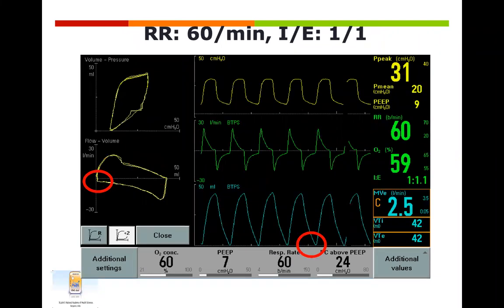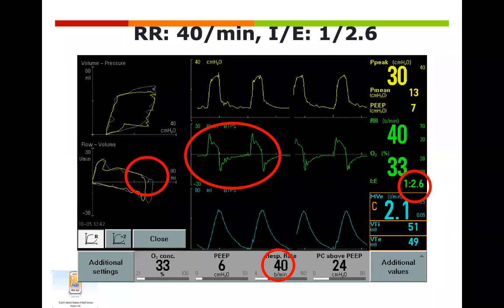Sorry for interrupting. I do that sometimes and it solves the problem sometimes. I like very high PEEP, by the way. I reach 16 and 17, and sometimes I reach 20 PEEP. I like PEEP, so I don't like PIP. We all would love PEEP rather than the PIP, which will cause volutrauma, barotrauma. That's why we go for high frequency ventilation, where we can give the maximum PEEP and cause less of this. So what happened here?